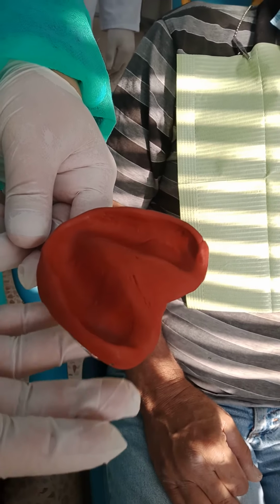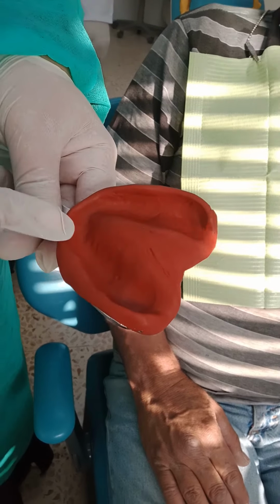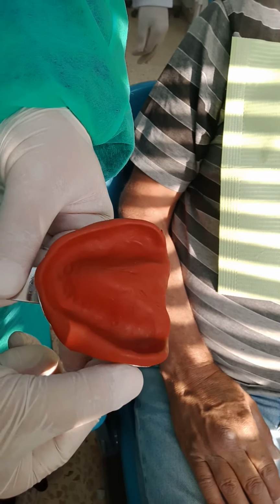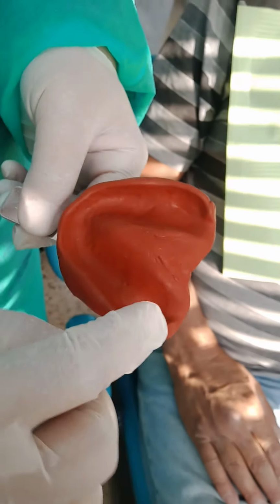What made me make this video was the anterior area. Posteriorly, you can see the sulcus is round and smooth. I need to measure this from inside the patient's mouth, so I go distobuccally from the tuberosity. You will see it in other videos in more detail. How much did my finger enter? This is the amount. I invert it and measure, then it was taken correctly. The other side, by the way, the left should not be like the right. If this has been recently extracted, it will have more bone. So it doesn't mean that the tuberosity on the left is the same as the right.